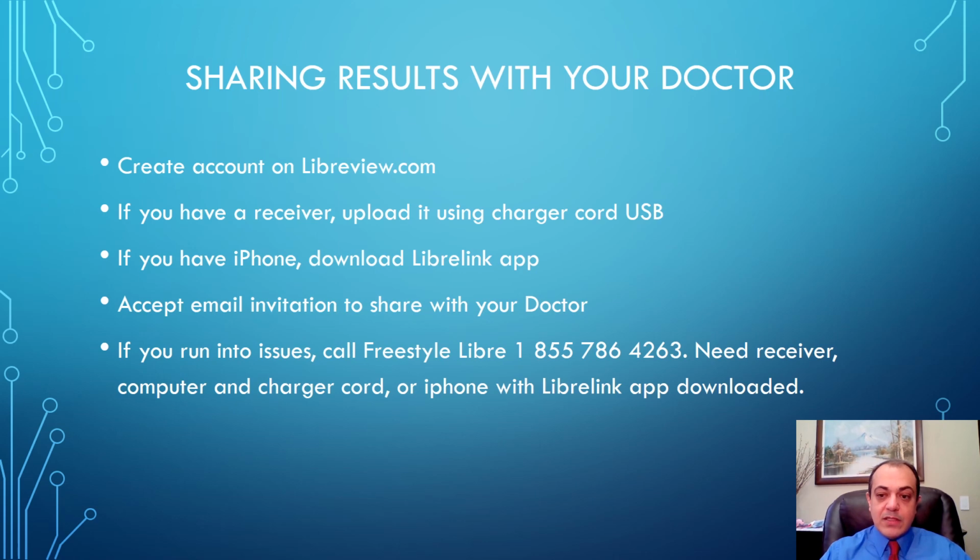So to put it in specific steps, as a patient, what do you need to do to get those results stored and shared? You first have to create an account on libreview.com. Then, if you have a receiver, which is the black box, upload it using the charger cord. If you have an iPhone, download the Libre Link app and use that to generate the report.